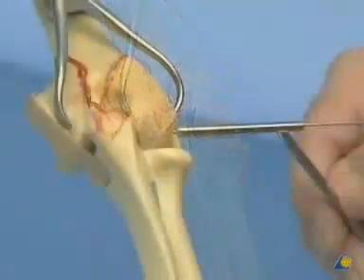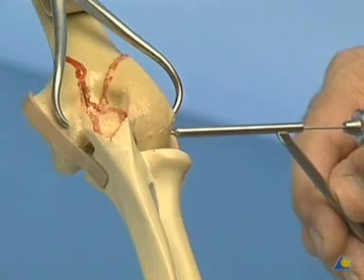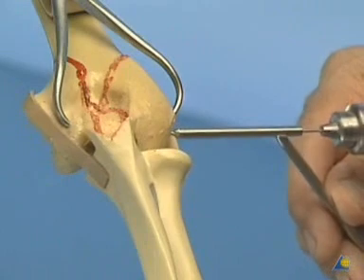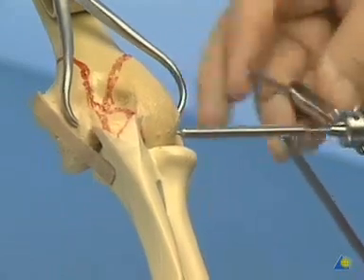The threaded K-wire, which can also serve as a reduction aid, is now drilled in the reverse direction, outside in, all across the 3 articular fragments. The correct reduction of the fragments, especially their rotation against each other, must be checked, because at this point, it can still be corrected.